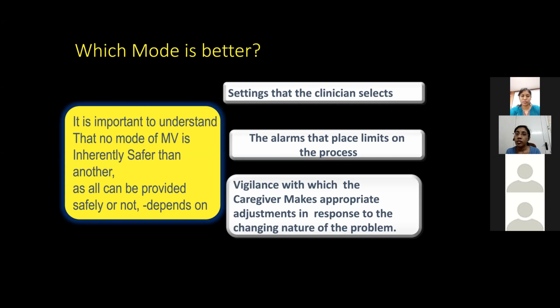So, concluding, there are 5 modes that ventilate all patients. If you look at all the studies that have been published, they have been done with only those 5 modes. So all the diseases, all the weaning, all the stabilization can be done with only those 5 modes. But there are advantages with advanced modes. If possible, we'll do the advanced modes in the next class.